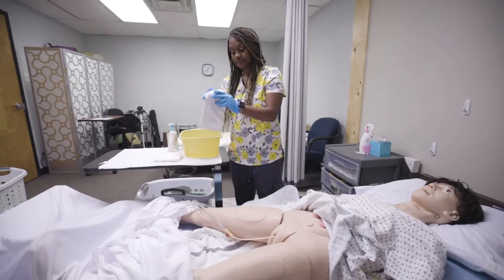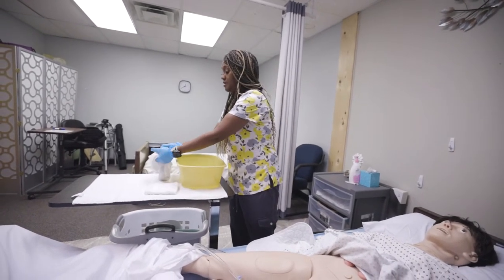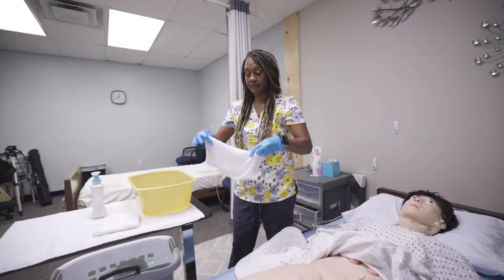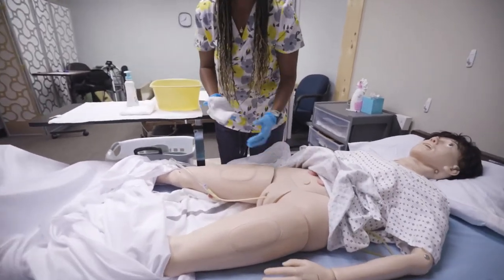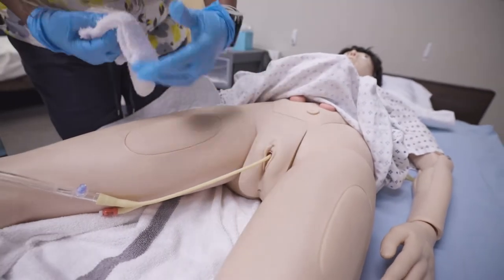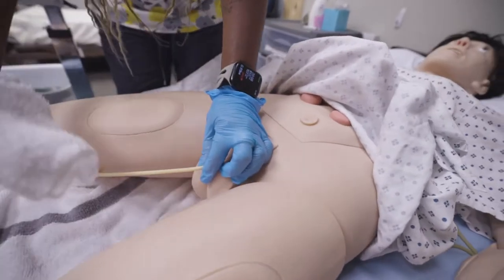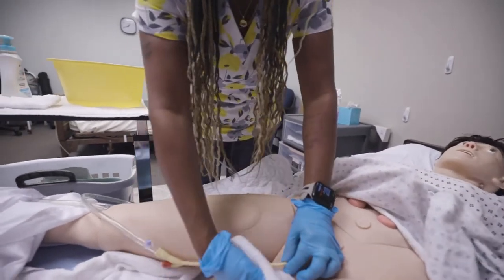I'm going to wet my towel and put soap on it — do not put soap over the water or into the water. Now I'll soak my towel and dab to avoid dripping on the bed. First I'm going to clean the labia. Here's the labia, the clitoris, the urine hole, and the vaginal opening. We start here and go down: spread the labia, wipe down — one; turn the towel to the other side, wipe down — two. Then open the towel to a fresh area, hold the catheter in place, wrap the towel around the tube, and go down without pulling, washing the full circumference.